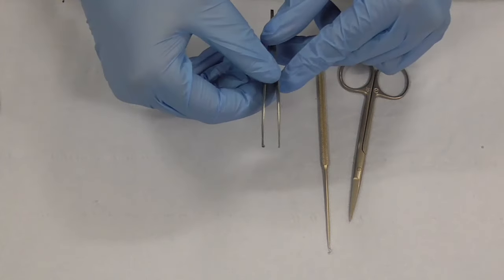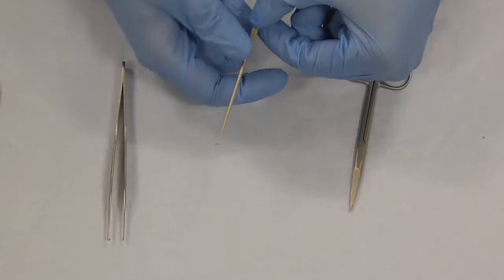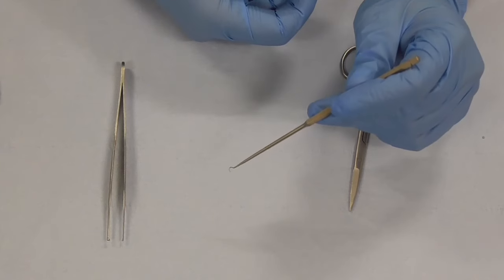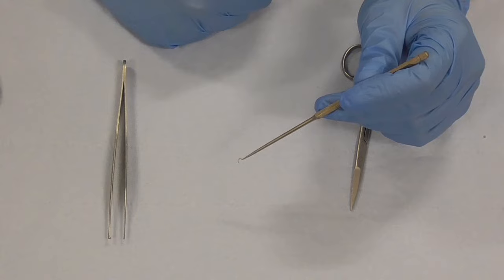Now the best way to hook it is not actually the dissecting forceps but to use a skin hook and then you can actually hook the skin, lift it and stitch and we will demonstrate that later on.